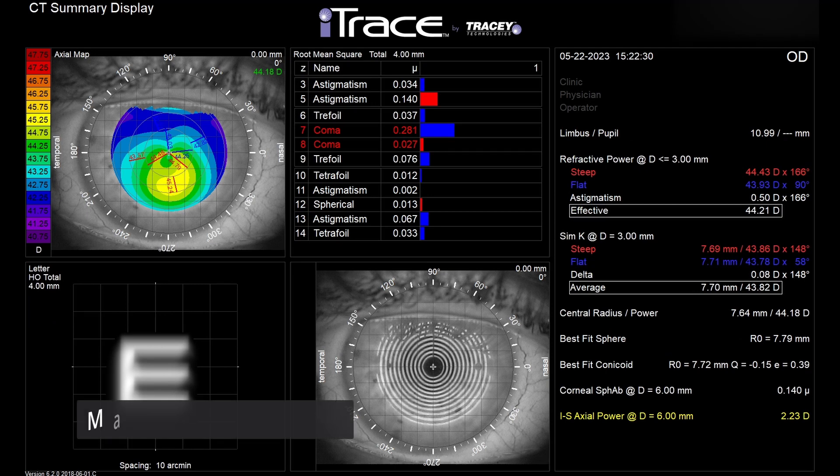The bottom line of iTrace is that this machine turns all these difficult concepts — like corneal aberrations and depth of focus — into easy-to-read maps. You don't need to be advanced in optics to understand how the eye and its optics function, thanks to these nice and easy-to-read maps.